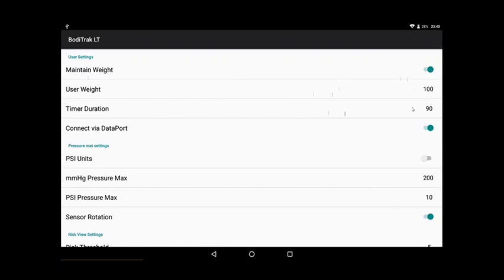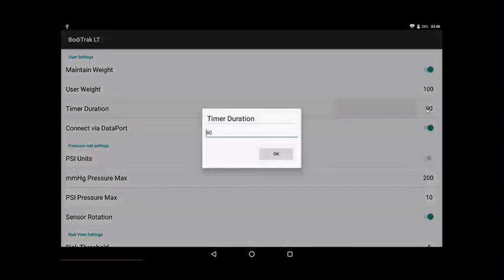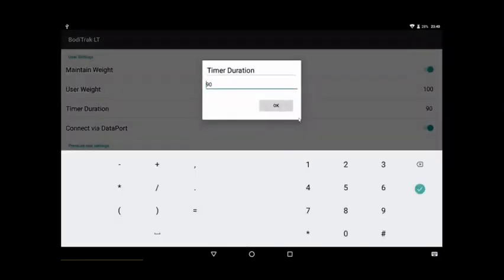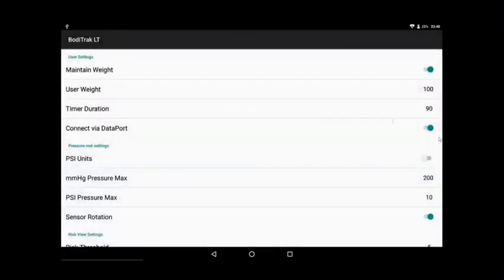Then you have timer duration. You can change this anytime you like by just clicking, as well as any of these other fields, putting a new number in, and then saying okay. Yes, we're using a data port. We're in wireless mode with a BodyTrack 2 sensor right now.